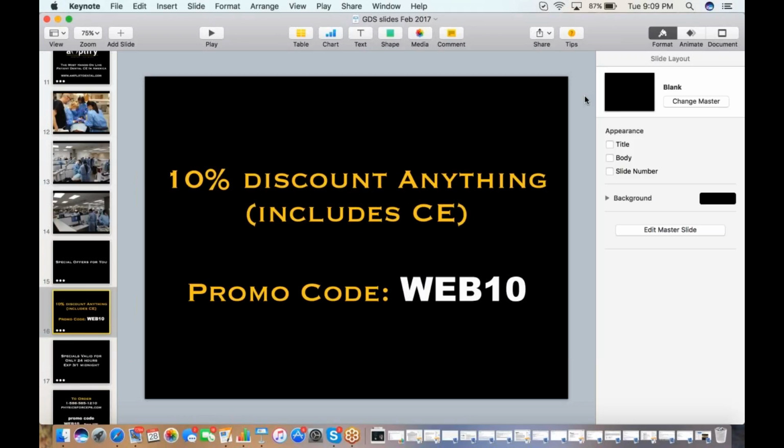Great. What I'm finding is very similar to the examples that I illustrated this evening. I'm using it for multiple areas. However, one could use it for single unit teeth replacement. I found that when you're doing multiple units, all of a sudden when you're using grafting material from a bottle and you're buying that, it gets quite costly. So I find that I'm usually doing it for multiple teeth, whether it's 2 or 3 teeth or more, as compared to the single tooth, just because of the time.